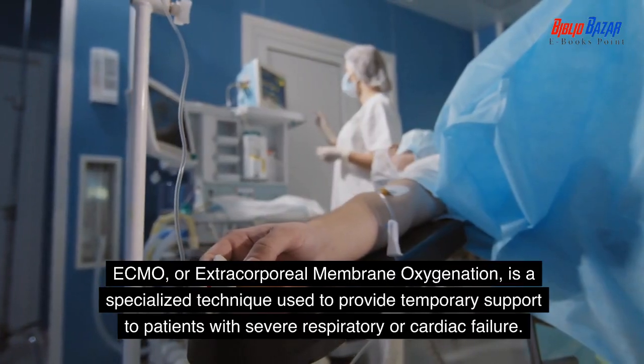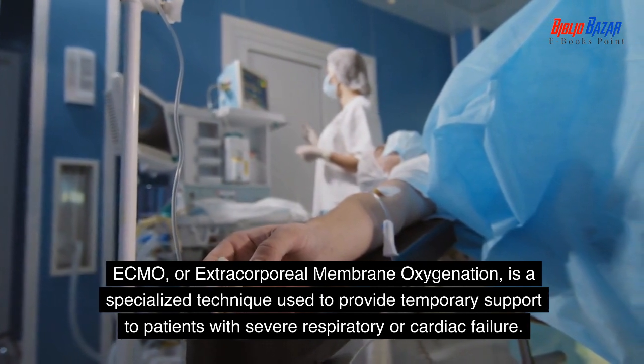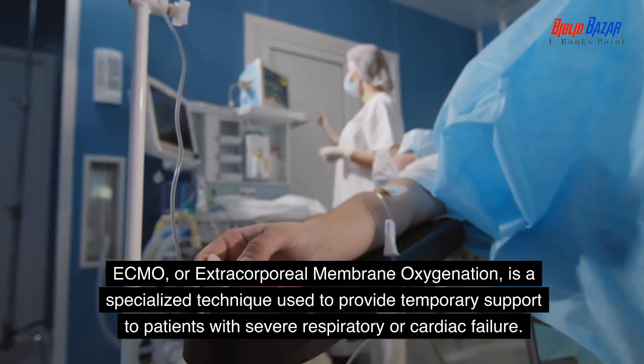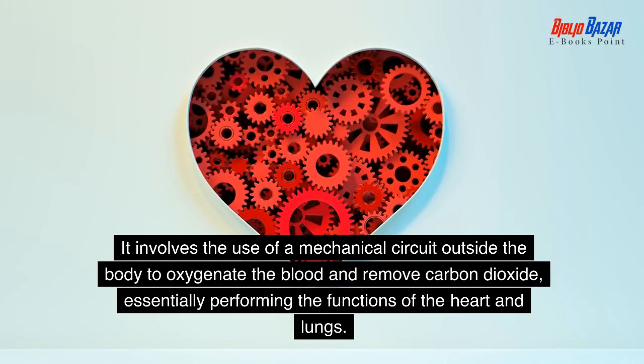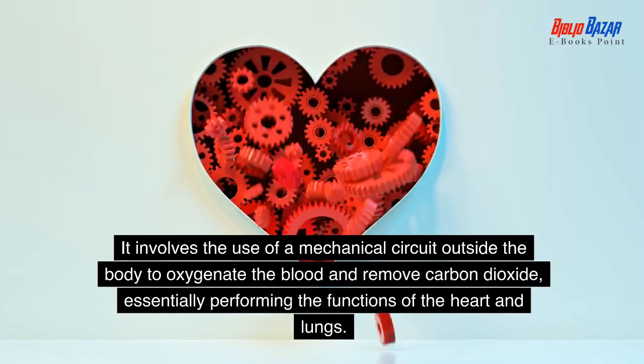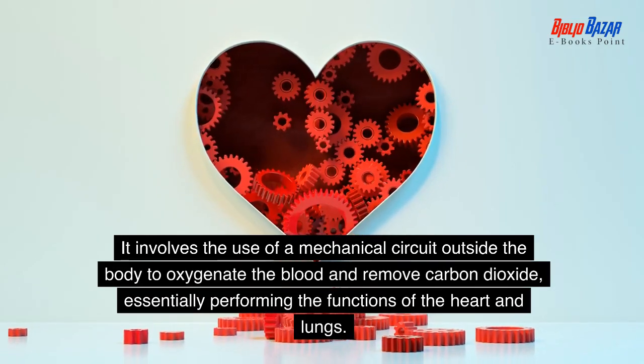ECMO, or extracorporeal membrane oxygenation, is a specialized technique used to provide temporary support to patients with severe respiratory or cardiac failure. It involves the use of a mechanical circuit outside the body to oxygenate the blood and remove carbon dioxide, essentially performing the functions of the heart and lungs.